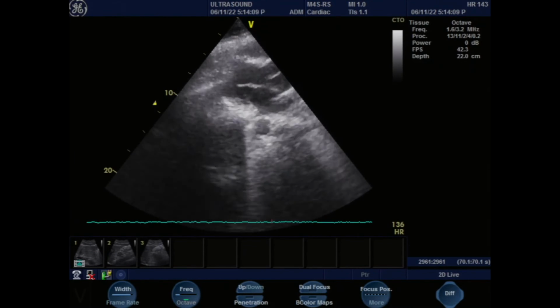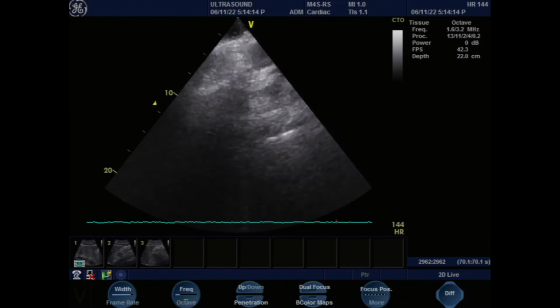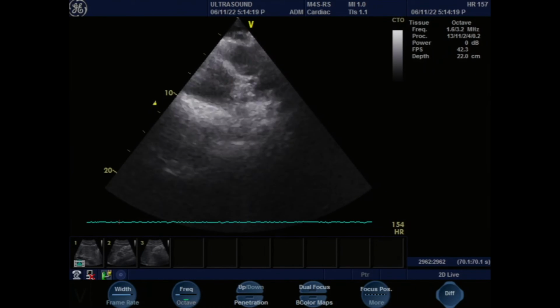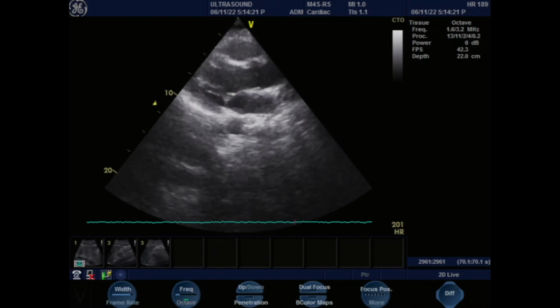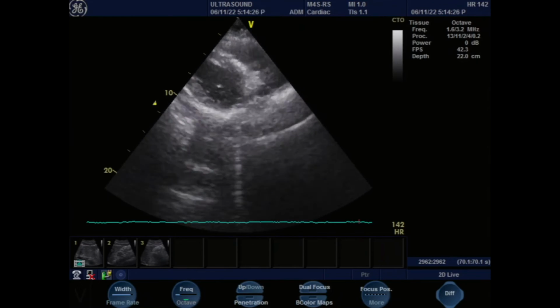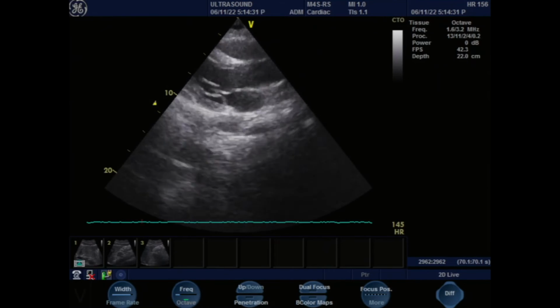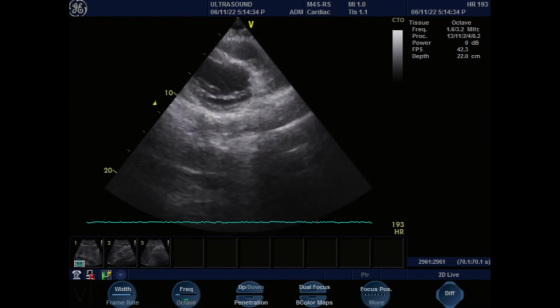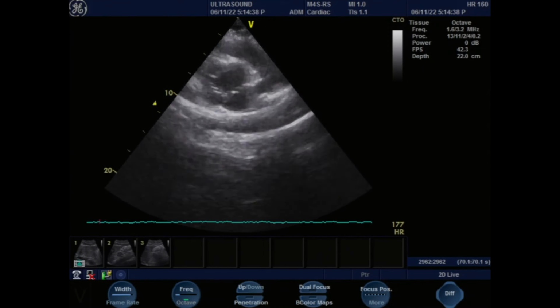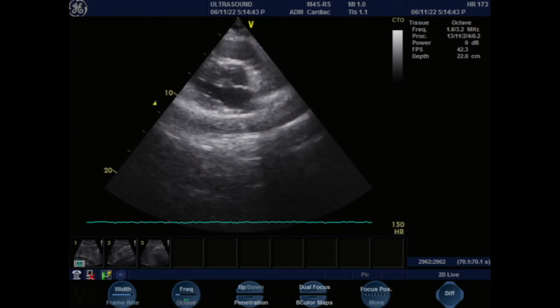Now, if you just turn this a little bit, there are some long axis views here. Keep it there, but just turn the probe like this. Very slight movements, see? Keep on turning slowly. Now you're changing it from the oblong to a circular view. You keep on going this way, now it's a circle. Now you see the complete mitral valve, instead of just two side leaflets. You keep on going, yeah.